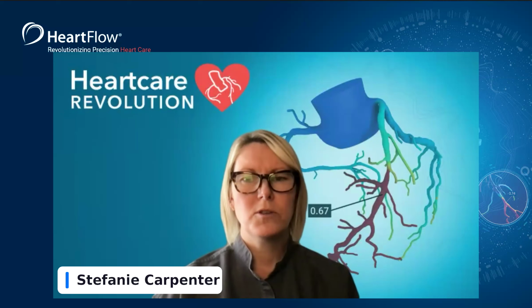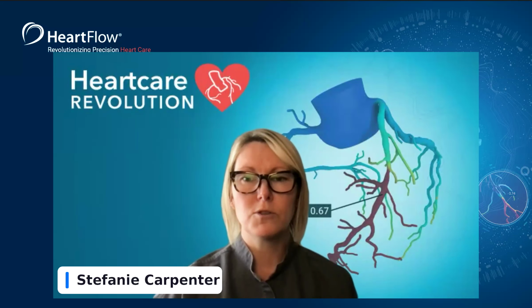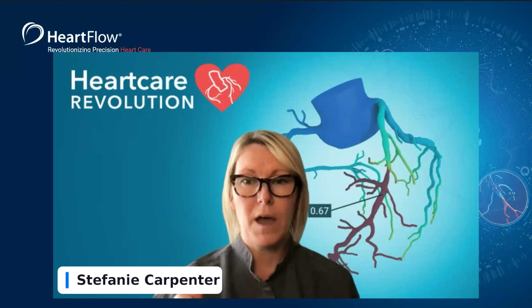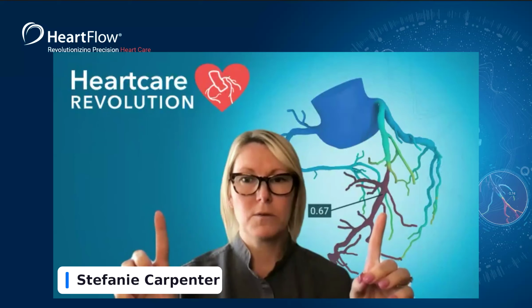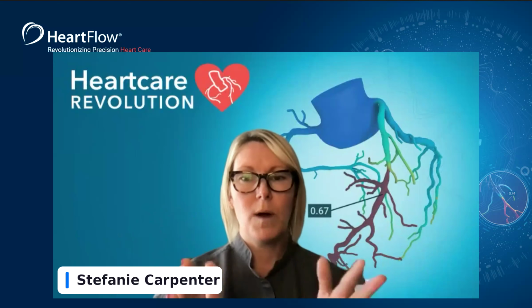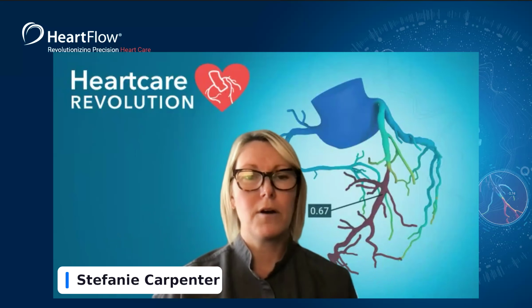So when you put your patient on the CT leads, you're measuring their ECG trace. You're using their ECG trace to trigger your X-ray, and then you're also using it to say where your reconstructions are going to be. You use the R peak to trigger and to measure, which is the peak that's going to go up the highest in that ECG trace. The slower the patient's heart rate, the farther apart your R peaks are going to get. There's a little bit of a quiet time, as I like to call it, kind of mid to the end of the R to R cycle.